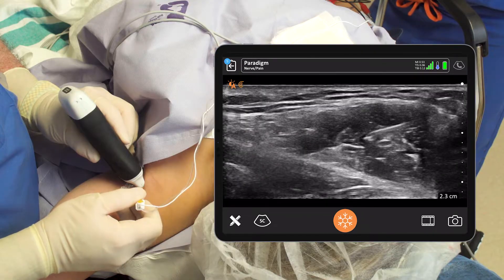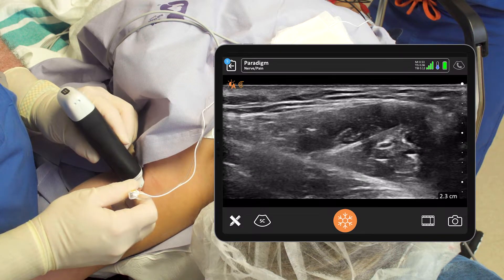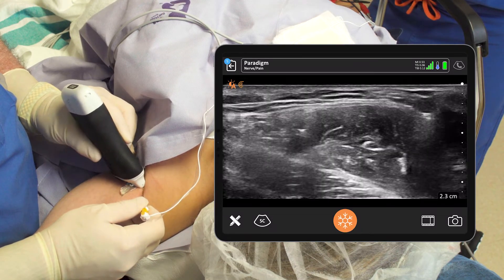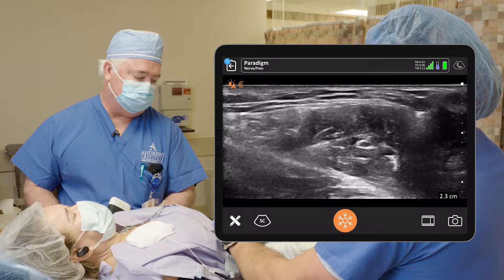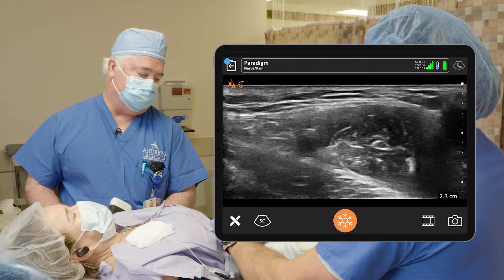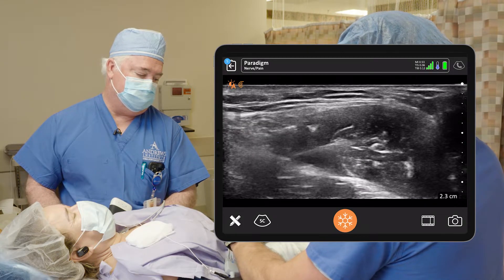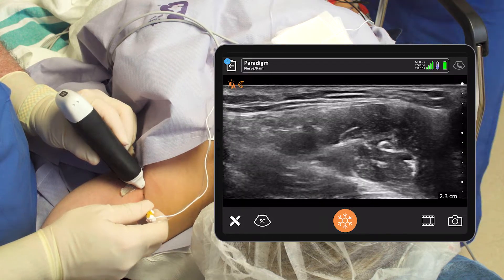Then we're going to go past that and go down deep to the artery and see if we can find the radial nerve. You can see our approach coming in, and sometimes the radial nerve is a little past the artery. So what we'll do is put some local under the artery, open up this space — that should spread around to the radial nerve. Then we'll go up on top of the artery and put some more when we get the median and ulnar nerve. Give me five right here. That's really good spread there around the artery from about eight o'clock to about five o'clock.